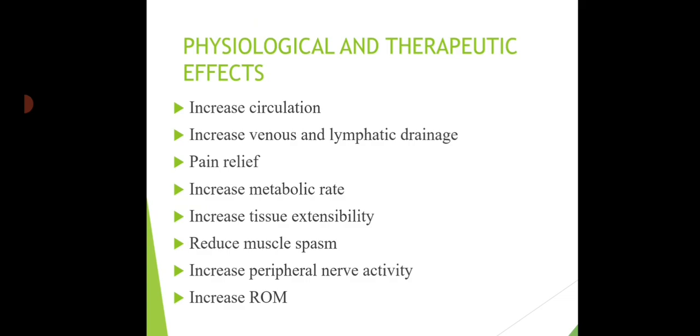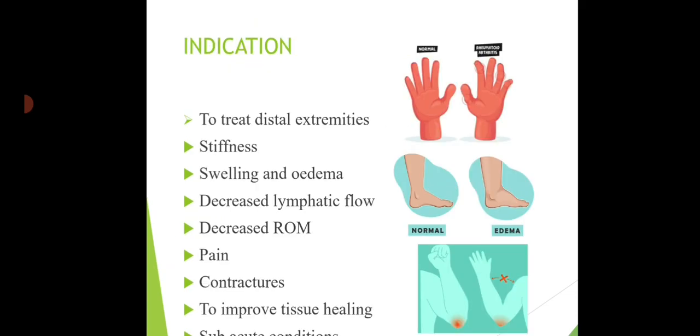It will increase the circulation. Fluidotherapy will increase venous and lymphatic drainage, and also relieves pain, increases metabolic rate, increases tissue extensibility, reduces muscle spasm, increases peripheral nerve activity, and also helps in increasing the range of motion.